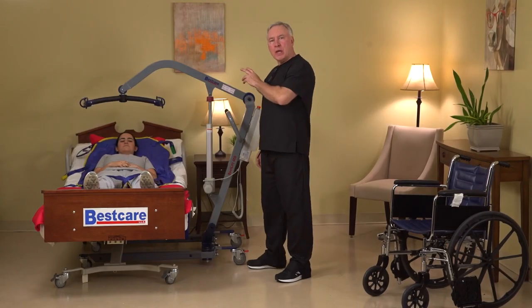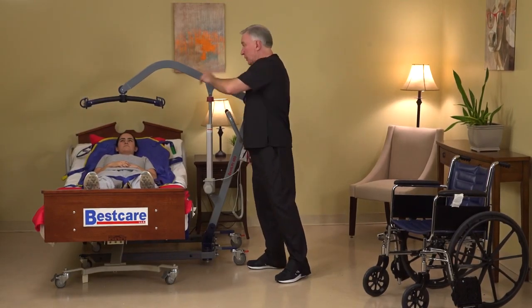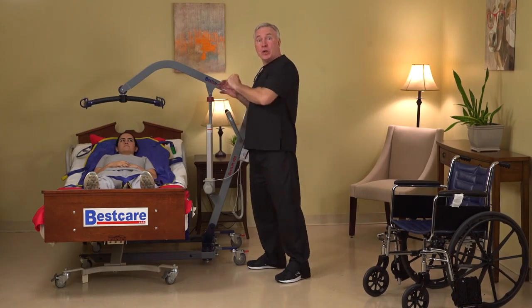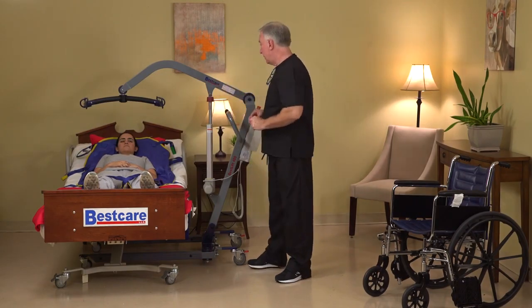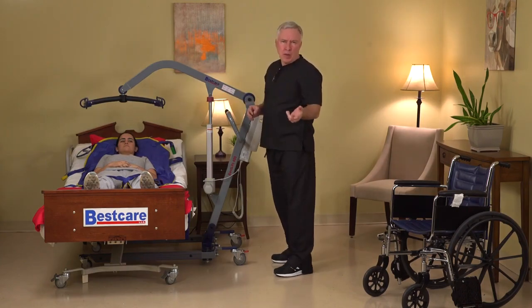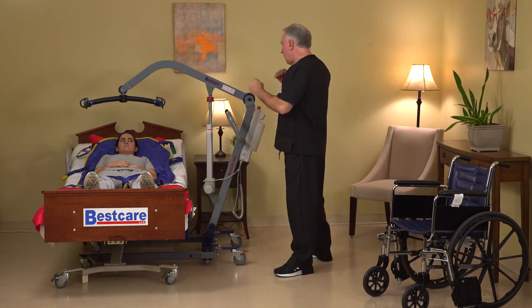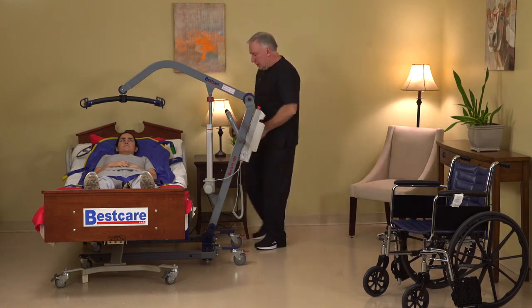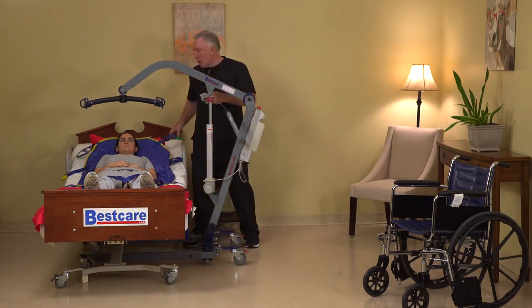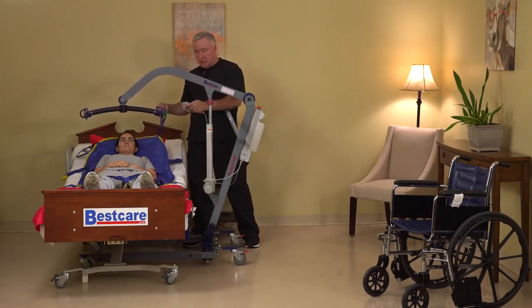So let's see how we're going to transfer our patient with our ProCare Series PL lifter with the 6-point spreader bar with our universal sling with head support. So you can see that the sling is already on the patient in the bed, and you can refer to one of my other videos about how to position the sling on the patient while they're in the bed. But our sling is already in place, so we're going to make sure that our spreader bar is close enough for us to connect our loops to the hooks.